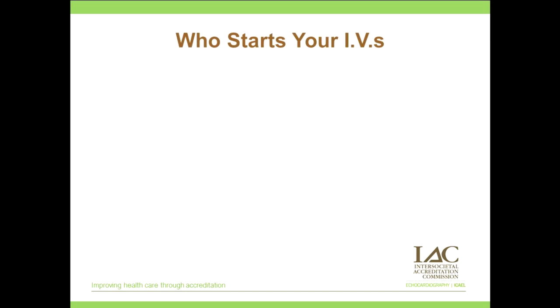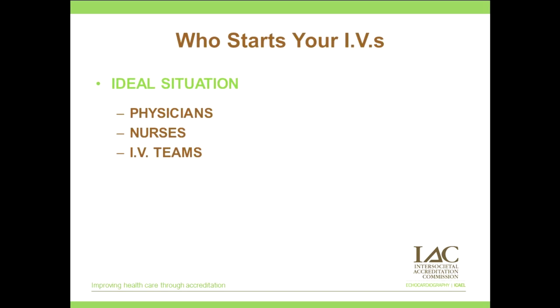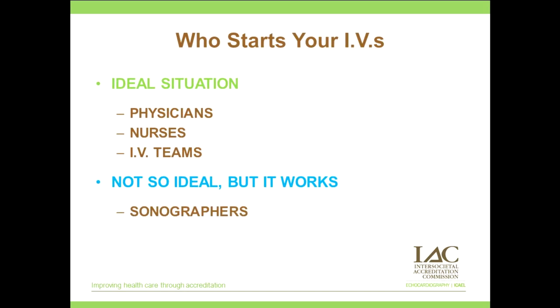So who starts the IVs? Well, this will vary from lab to lab, and it really comes down to who's been trained and who's available. So the ideal situation is either having the physician, they can start IVs, nurses can start IVs. If you work in a hospital, hospitals a lot of times have IV teams. Now, the question is, are they readily available? Unfortunately, sometimes they're not. So maybe not so ideal, but it works, is us, the sonographers. Oh, yeah.